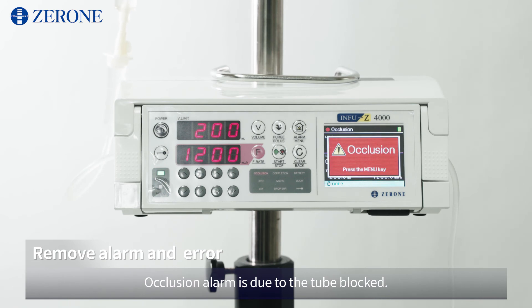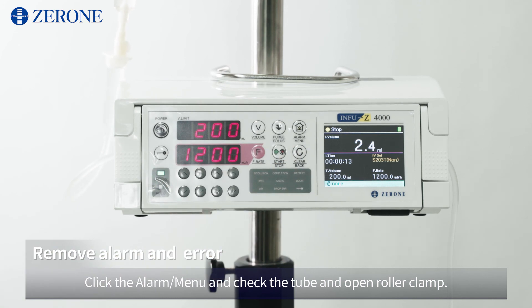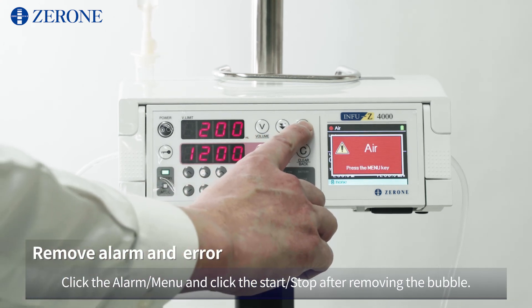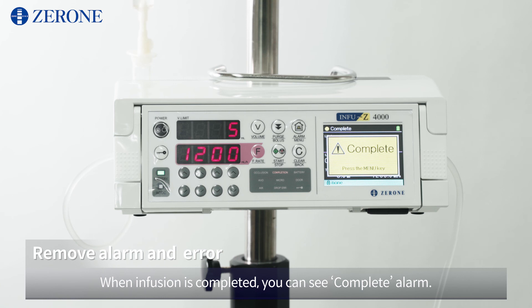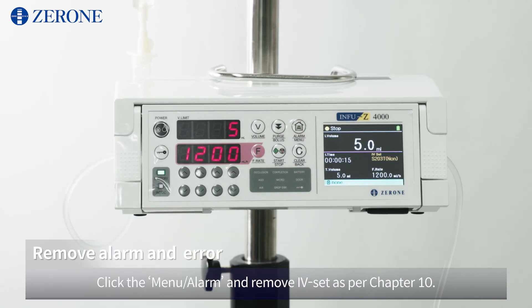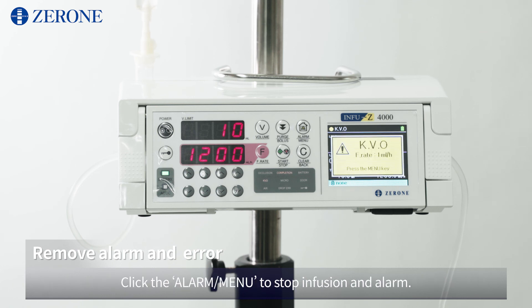Occlusion alarm is due to the tube being blocked. Click the alarm/menu and check the tube and open the roller clamp. Air alarm occurs when an air bubble is recognized in the line. Click the alarm/menu and click start/stop after removing the bubble. When infusion is completed, you will see a complete alarm. Click the alarm/menu and remove the IV set as per Chapter 10. After infusion is completed, it will be done according to the setting under KVO mode. Click the alarm/menu to stop infusion and alarm.